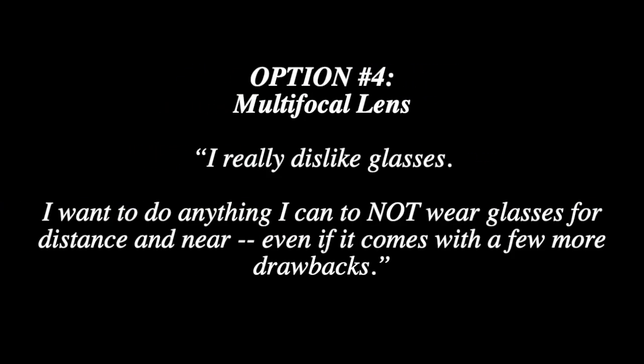This is option 4, the multifocal lens. This is the lens for patients who say, I really dislike glasses, and I want to do anything I can to not wear glasses for the distance and up close, even if it comes with a few more drawbacks. This lens gives you the best chance to be able to see the distance and up close without wearing glasses. The drawbacks are that some patients still find that they need to wear glasses to see up close.